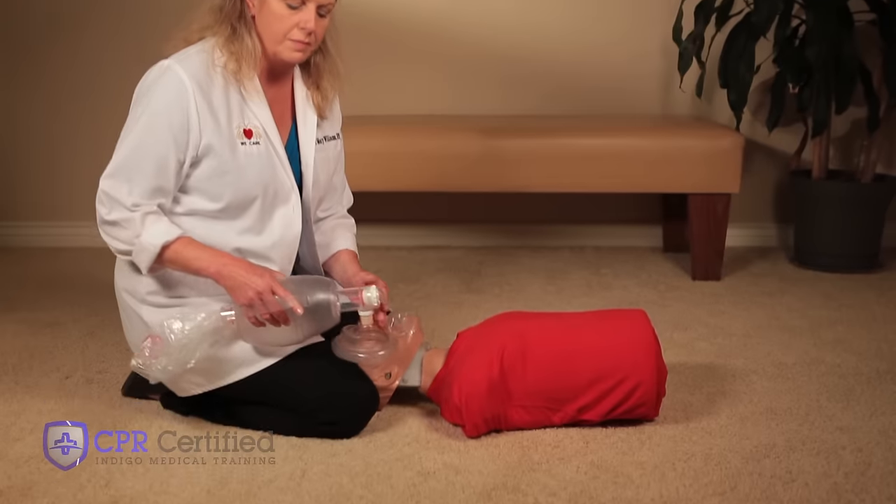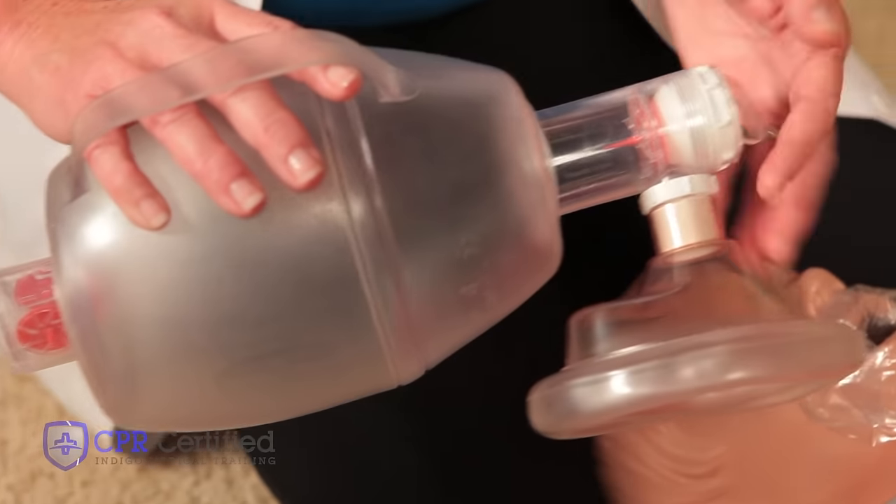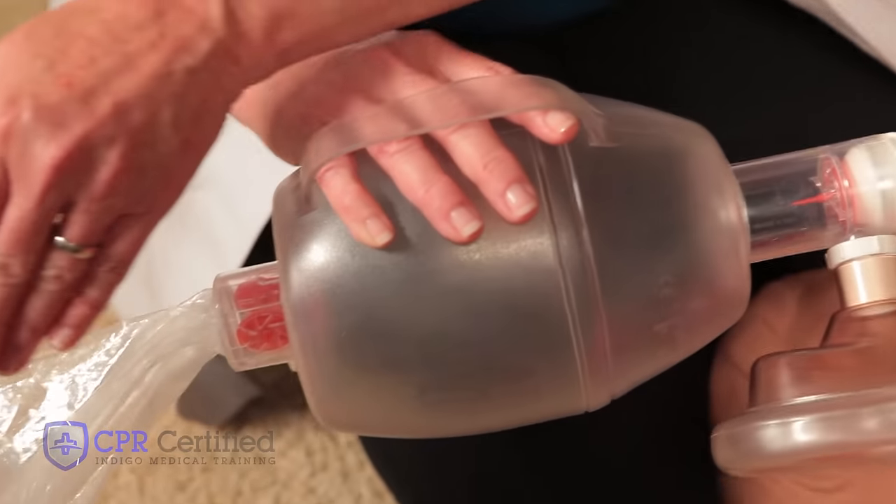When using an Ambu bag for CPR, it's easiest to stabilize the victim's head between your knees while you administer it. On an Ambu bag, there is a mouthpiece and a balloon-shaped bag.